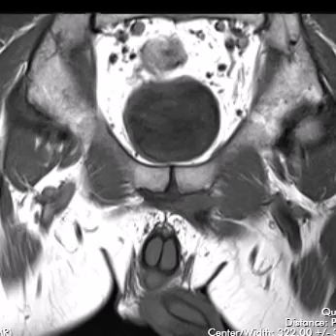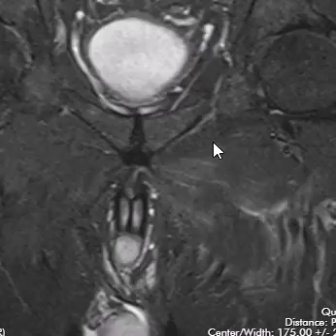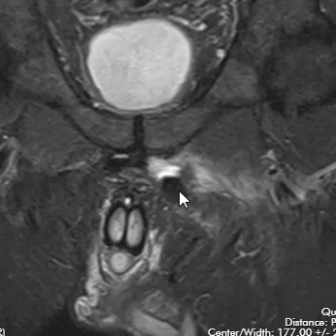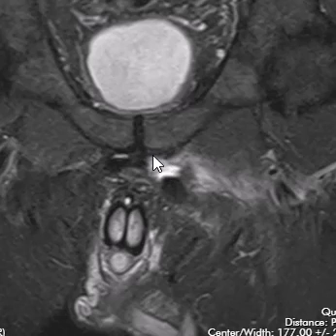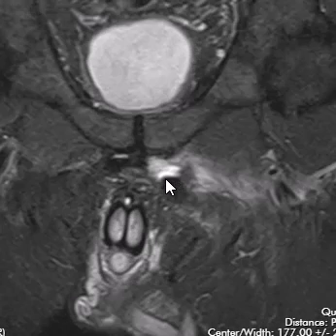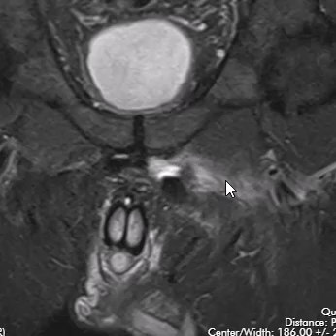Now looking at a T2-weighted sequence — a coronal STIR sequence — we can see the same findings confirmed. Here is the adductor longus: it comes up and should attach right there, but you can see how it's pulled off and pulled down. There is a little bit of fluid at the site of the tear, and we can also see edema in the surrounding deep muscles — a little strain of those surrounding deep muscles.